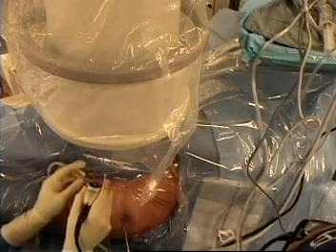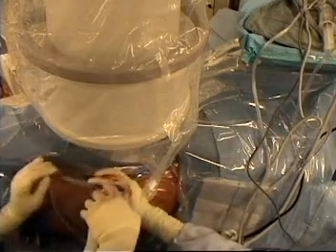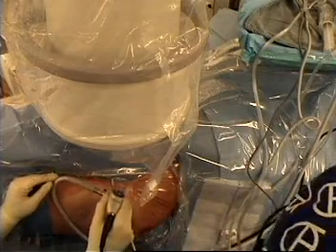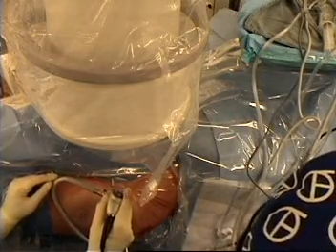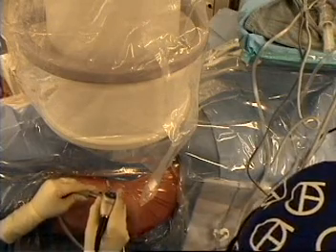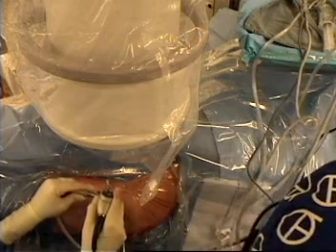We are going to open the hip repair set — the labral repair. So we are going to look at it this way, exactly where we have it there. You can see the separation area between the capsule and labrum. That is it right there.